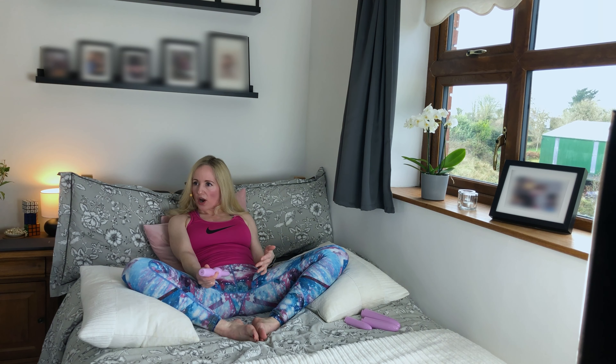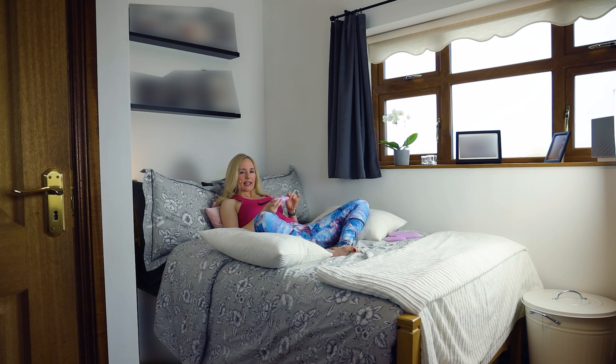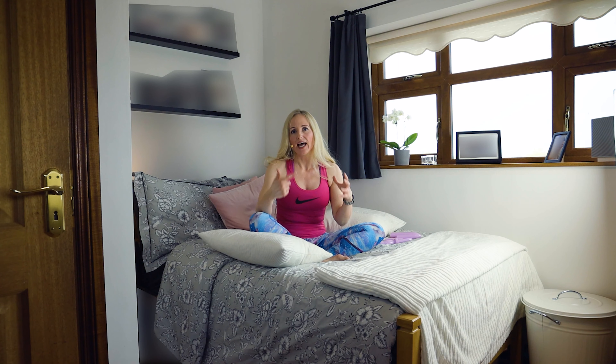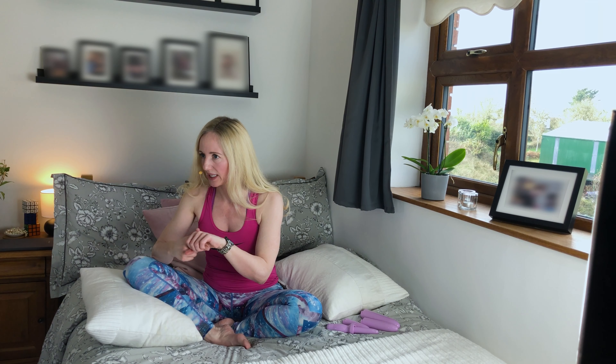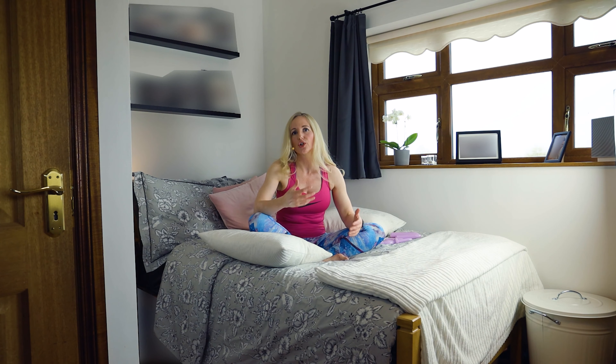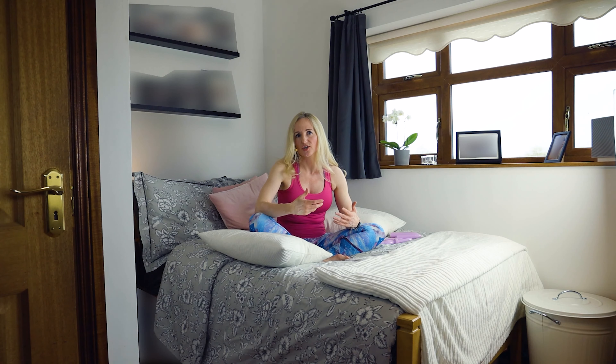Get everything to relax, then take your dilator and start with a very slow and gentle insertion — putting it in and taking it out. I've heard people say you should put the dilator all the way in and leave it in for 10 or 15 minutes — that's not really ideal. What you want to do as much as possible is mimic penetration: put the dilator in and out, allowing the muscles to feel it going in and coming out, rather than just leaving it in there. Practice in the same way as you would actually go through the act when eventually trying to achieve penetration.